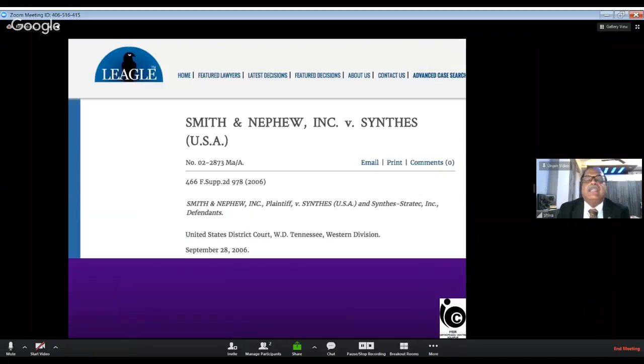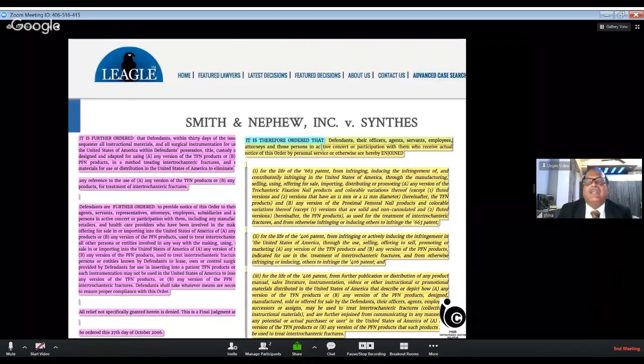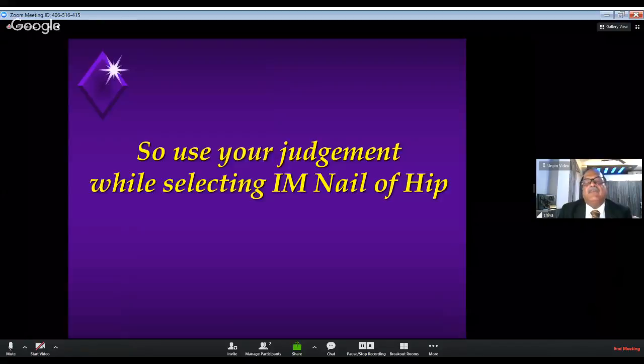Friends, the reason why we don't have PFN by other companies is only because PFN is patented. Any other company cannot use it. There are so many court cases going on, and the verdict is that till about 2025 PFN will be patented. Once the 20-year period is over, probably that is when other people will get a chance to manufacture their own PFN. Till that time, they will blame PFN to sell their own product, because the market for hip fractures and the implants required is very, very high, and everybody wants their own share in this huge market.